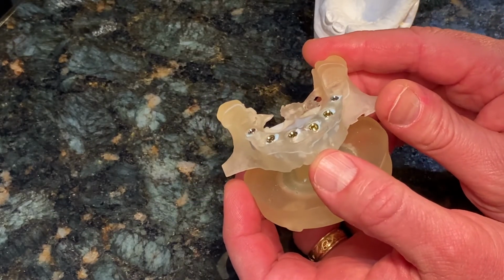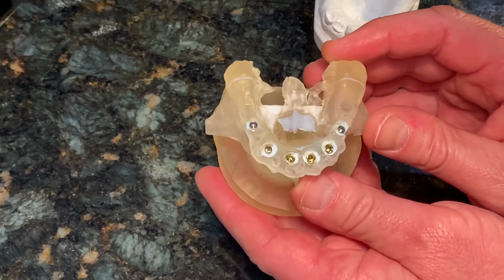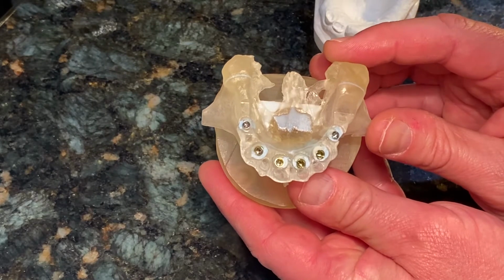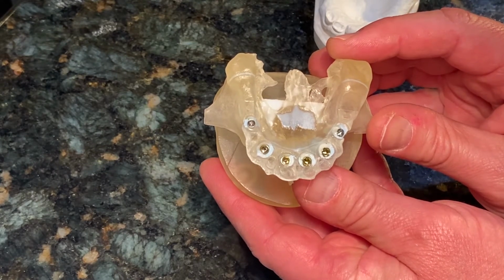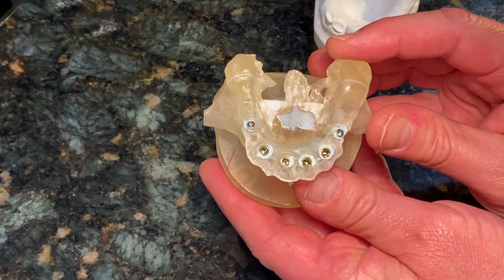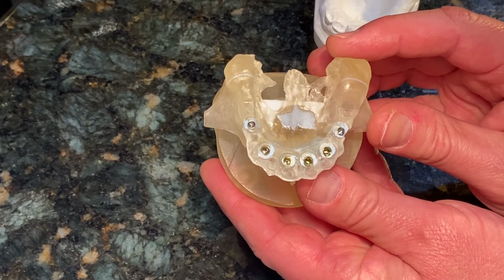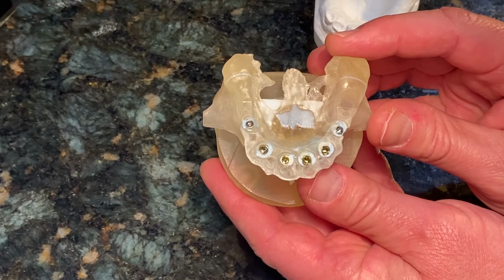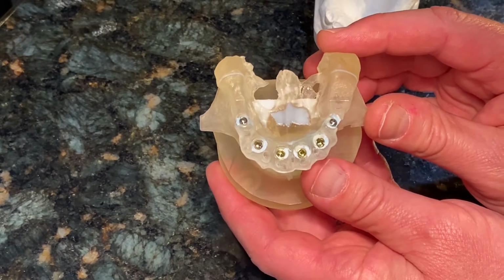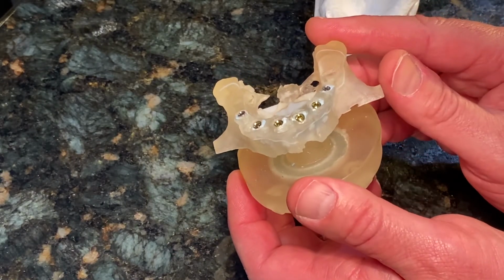And really, what's most interesting here and important is just the precision, the extreme amount of precision that we're able to place these implants, and that's very important for the strength, the success of the case, aesthetics, just ideal location. It predicts the parts that we're going to need, and it also ensures that the temporary, like I said before, is very, very accurate with minimal adjustment necessary.